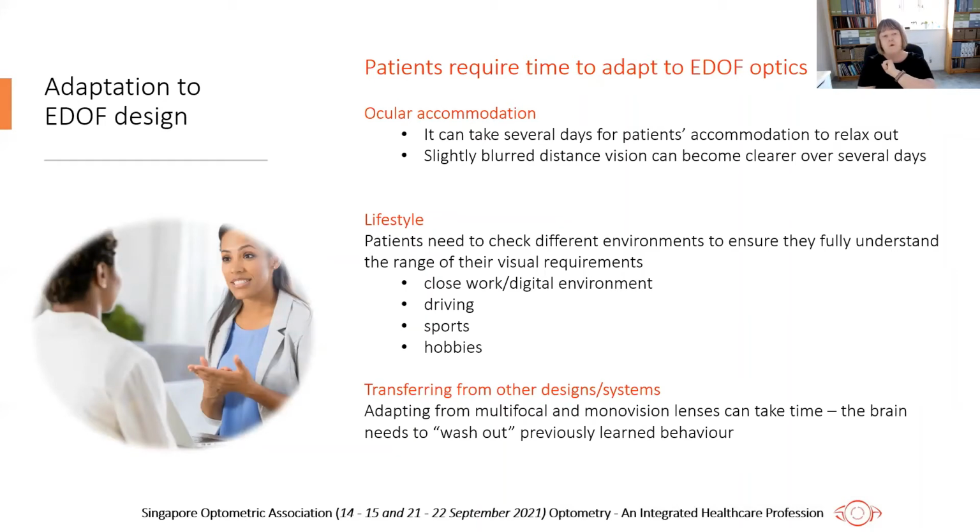So once you've optimized your patient so far, it will take time to adapt to EDOF optics. You're extending the depth of focus. You're giving them a different type of visual experience. You want them to understand that and get used to that experience in their own natural environment and with their own lifestyle.